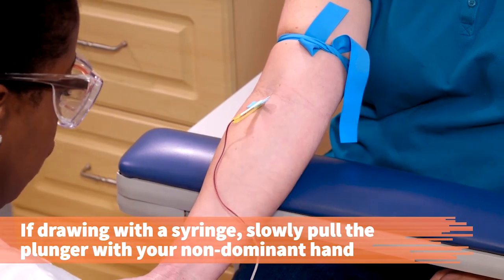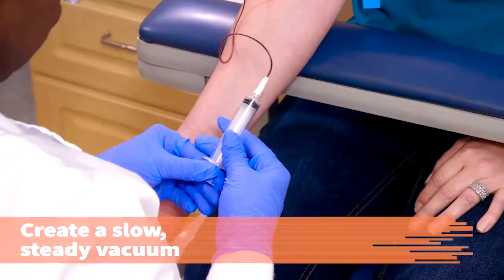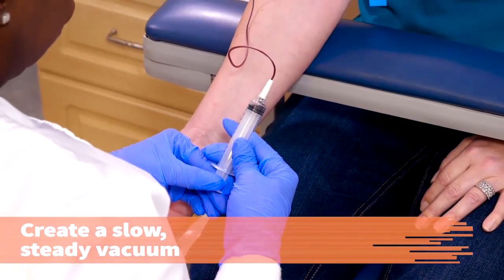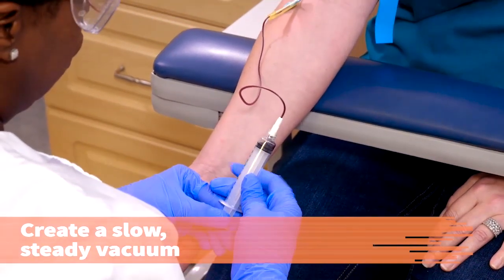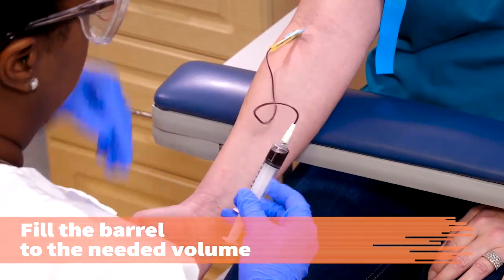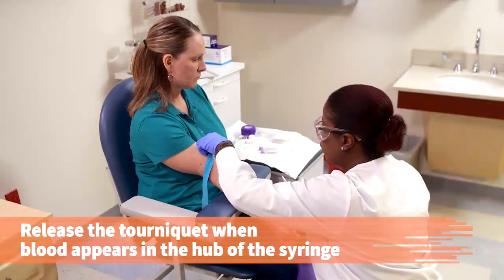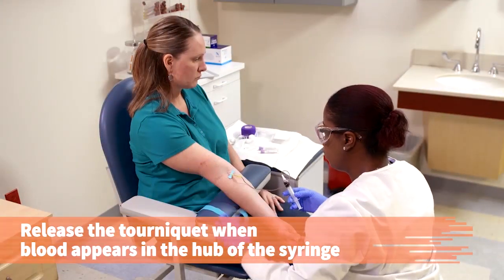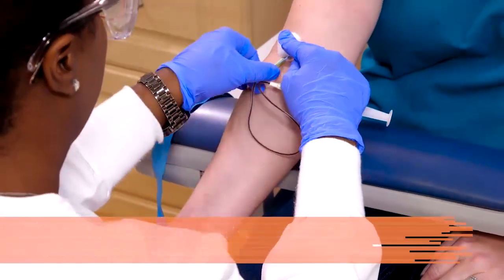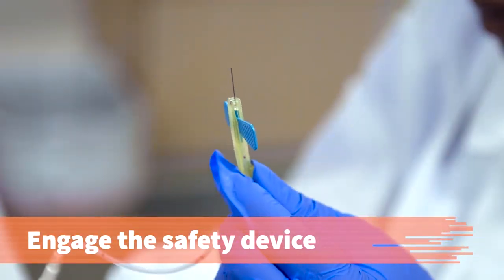Slowly pull back the plunger of the syringe. Make sure the vacuum you create is slow and steady and that no more than one milliliter of head space exists between the blood and the plunger. Fill the barrel of the syringe to the needed volume. Release the tourniquet. Place a gauze pad or cotton ball over the puncture site and gently remove the needle, engaging the safety device.